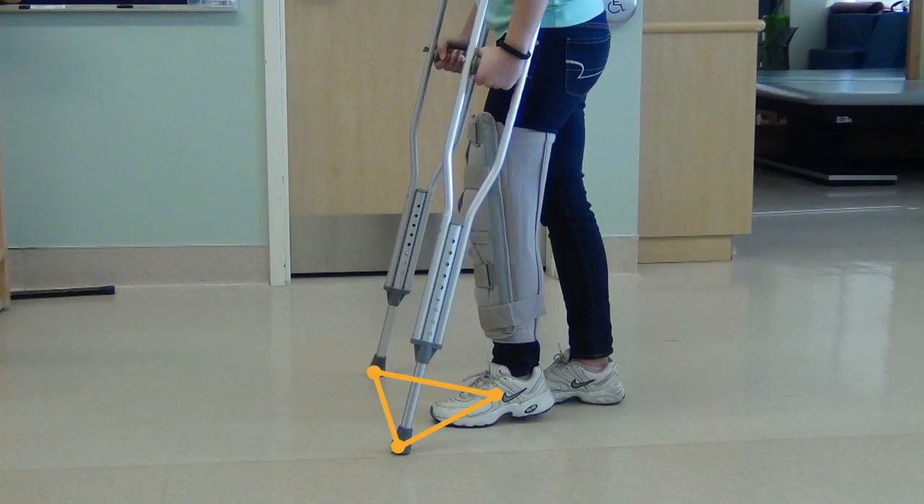When standing, it's okay to rest your injured leg on the ground. Place both crutches in front of you so that your legs and crutches are in a tripod position.